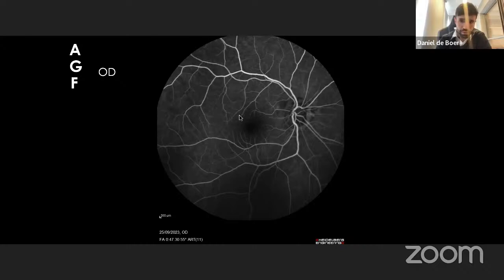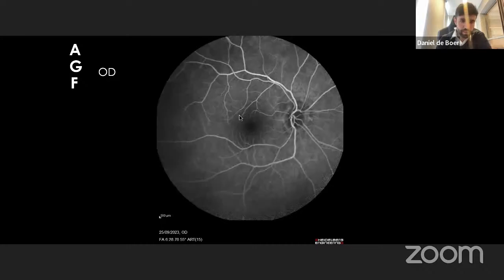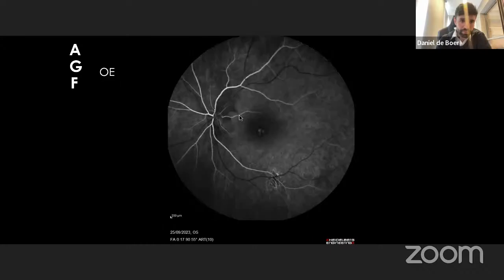Então, na angioflúor do olho direito, também não apresentava alterações, conforme é possível observar nas fases posteriores do exame. E na angiofluorescinografia do olho esquerdo, é possível observar ao redor da região de atrofia na arcada temporal inferior um extravasamento que vai aumentando durante o exame e um defeito em janela, possível ver já nas fases iniciais do exame.